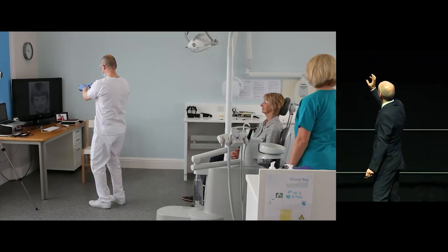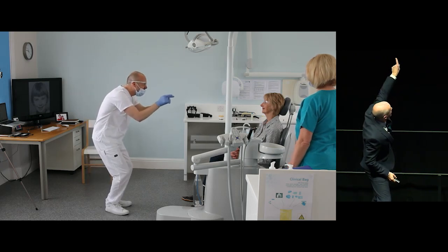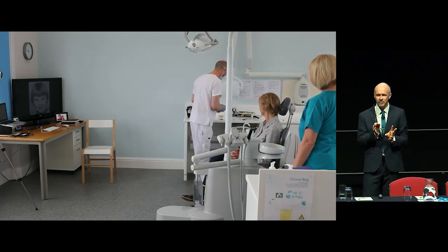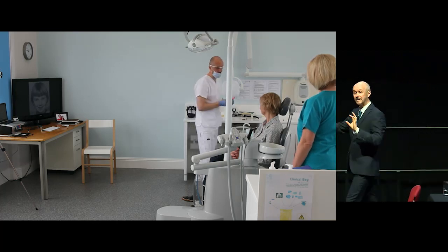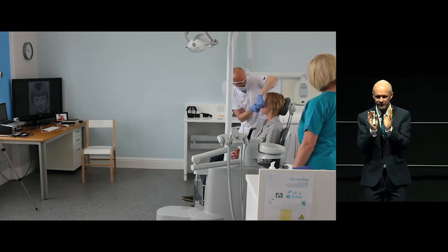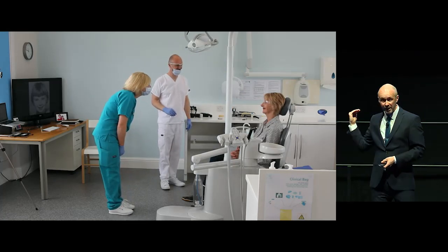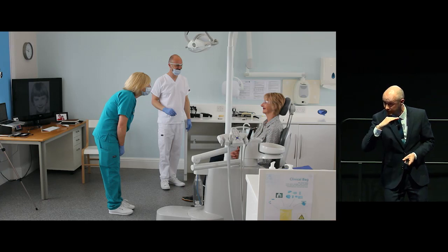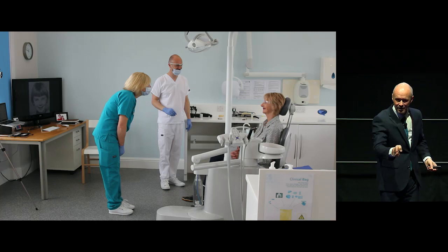The way I achieve this good aesthetic result is by having a photograph. This is Julie — that's her at age 12 in the photo. She's got a wax rim in her mouth, just a conventional wax rim, and I carve that with reference to the photograph. I really want to get a mental picture of Julie if she had her natural teeth now. The sequence for carving the rim is: lip support first, incisal plane second relative to the interpupillary line, occlusal plane parallel with the ala-tragus, buccal corridors according to the photo, and centreline according to the photo.